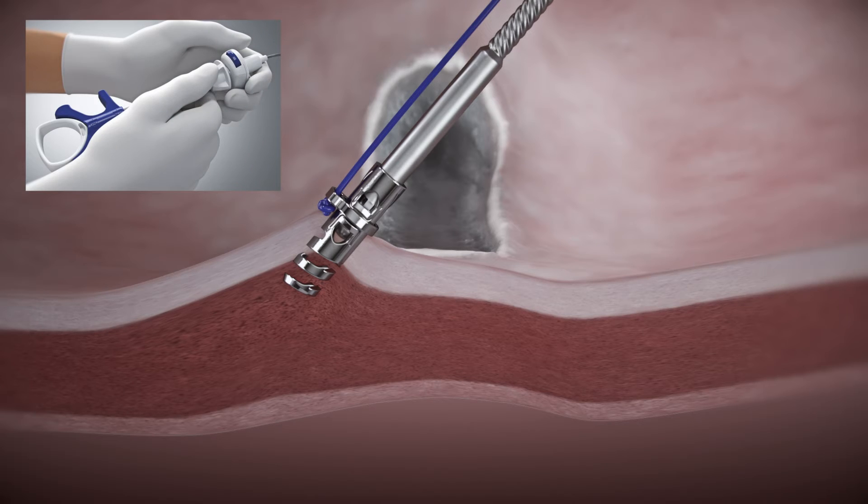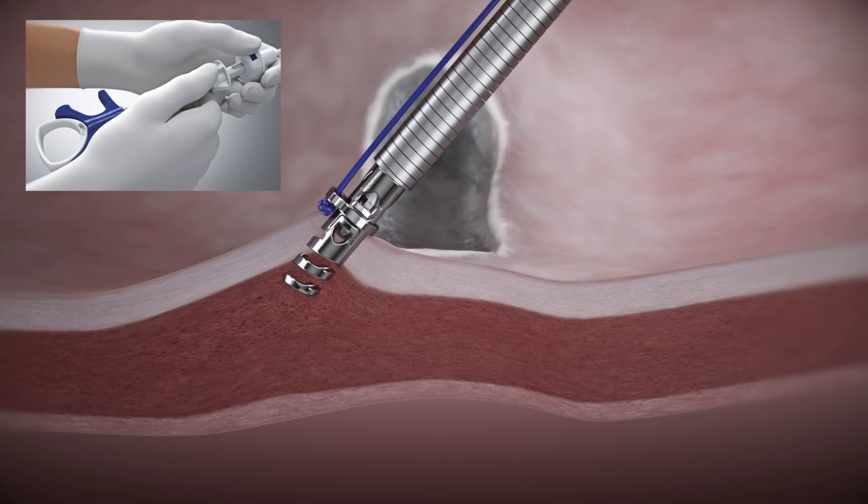To deploy the helix TAC, ensure the handle slider is in the D position. Press and hold the blue release button while advancing the push catheter forward until the hard stop is reached.